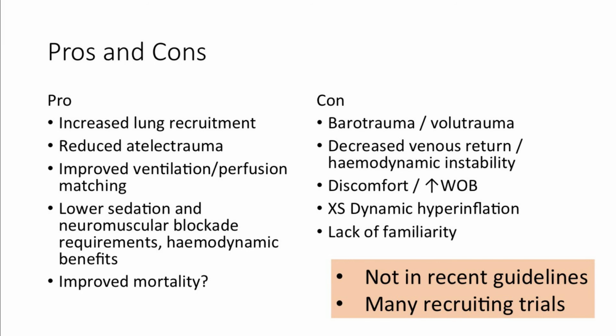But the cons are, you've got a really high airway pressure all the time, so you can cause barotrauma and volume trauma. Definitely you get decreased venous return, for the same reason as when you're doing recruitment. It can be uncomfortable. It can look uncomfortable, as you can imagine. If they're breathing at 30 centimetres of water on top of that, it looks a bit weird. You can get dynamic hyperinflation.